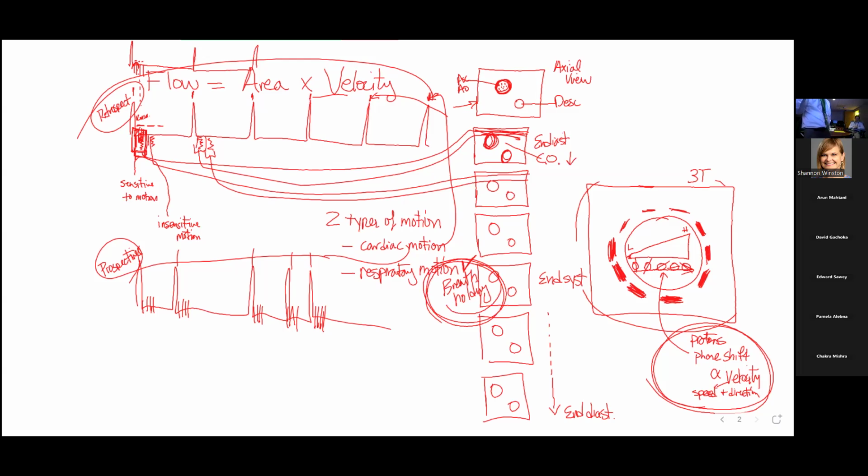And that's kind of tricky sometimes because some people just can't avoid that, especially when they get up inside the bore of this scanner, they get nervous and they may even forget. So number one, A, was breath holding.